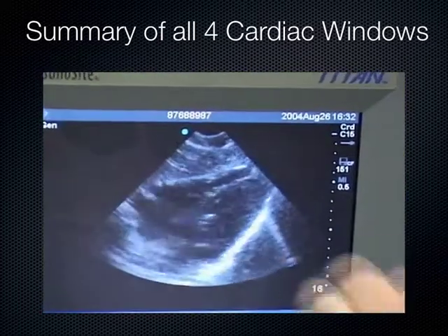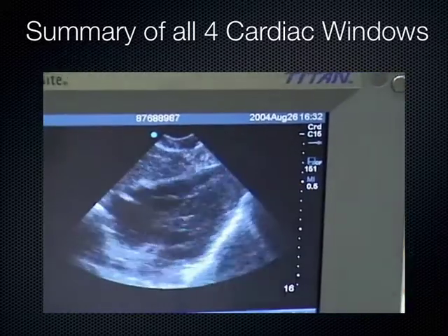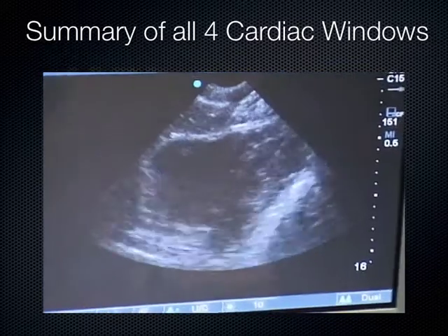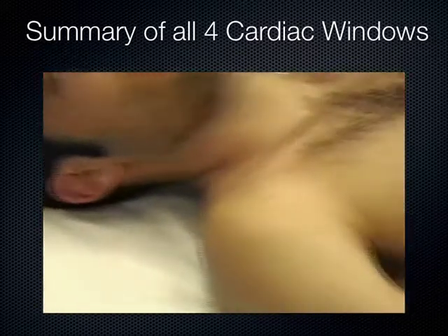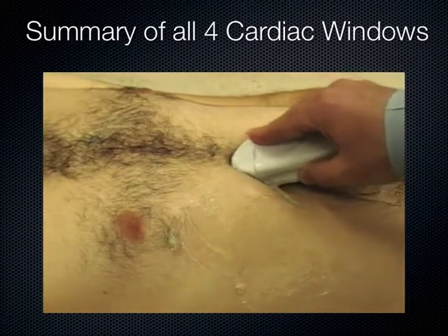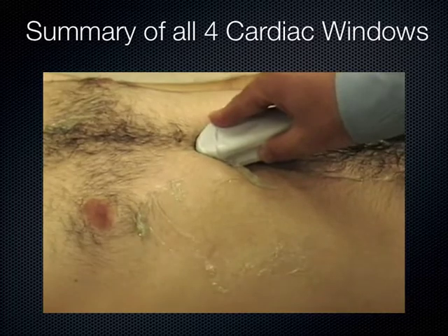And what we're looking at here, this is the right ventricle, right atrium, left atrium, and there's the septum. This is just a very quick overview to kind of get your feet wet. So that's the subcostal view. Again, if you look at the probe here, the indicator is towards his right. I just looked at the liver, and I saw the liver, and then I saw the heart. That's the way you do it. You start at the liver, you slide up into that fossa till you see the heart.